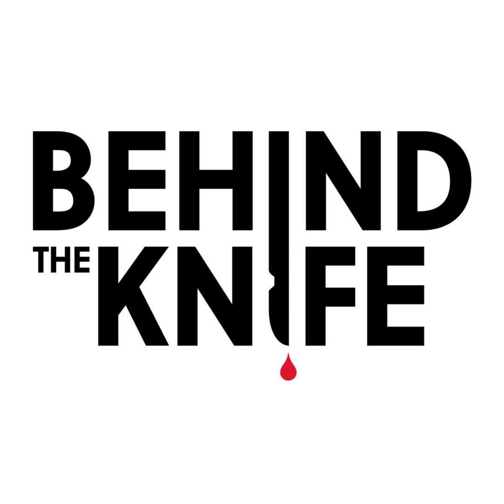What I do have concerns about in today's world is taking apart the whole abdominal wall and doing all these advanced TARs with a biologic or an absorbable synthetic. I would say use those as intraperitoneal meshes, give it your best shot, but don't violate things in these hard situations for the definitive repair. So my choice is never whether I am using biologic or absorbable synthetic. My choice is reconstruction, yes or no. And if yes, it will always be a synthetic mesh, because that's how I made that choice.